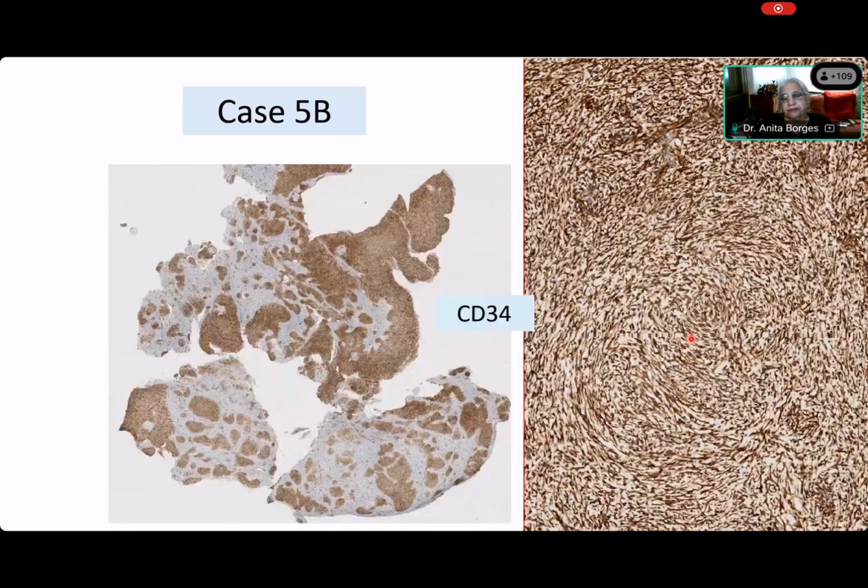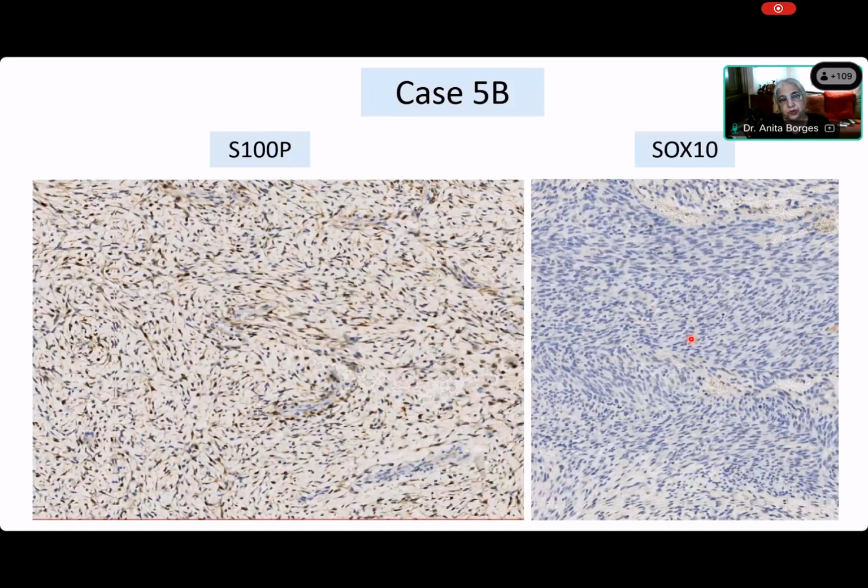Now we come to 5B. I told you CD34 was positive. Look at the amount of CD34. S100 protein is positive. You see that? It's nuclear positivity. You never read an S100 protein as positive in a sarcoma unless it is nuclear. S100 protein may be positive in the cytoplasm of histiocytes, but you never read it as positive in anything else. Melanoma, sarcoma, any other thing. Apart from histiocytes, it has to be in the nucleus.